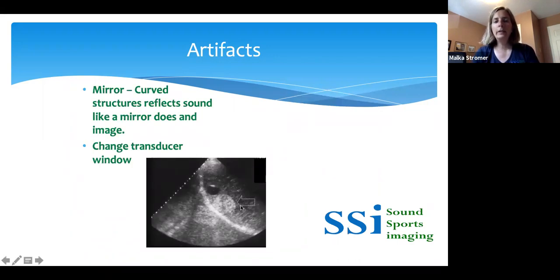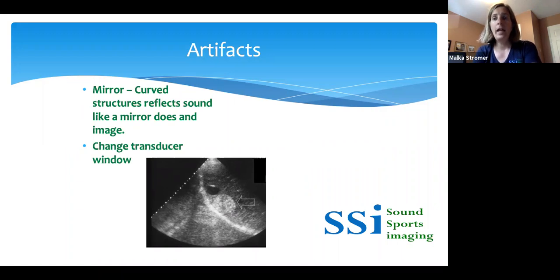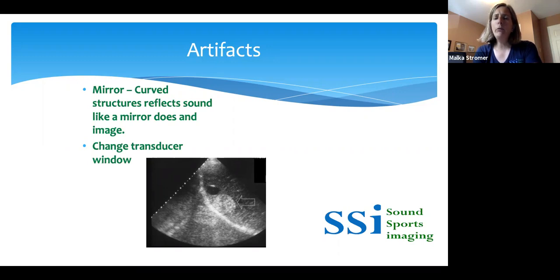Mirror image artifact: this is an image of the liver with an echogenic mass within it, and then on the other side of the diaphragm, another echogenic mass appears. That can't be right — there can't be a mass in the same place in both the liver and the lung. This is a mirror image artifact that often happens with a large specular reflector such as the diaphragm. A mirror image is very helpful — if we see one, it's indicative of a normal pleural space. If we're not seeing a mirror image artifact, we may question that the pleural space is abnormal.